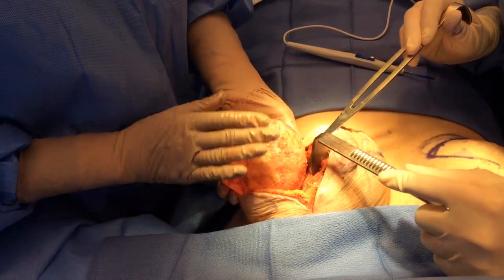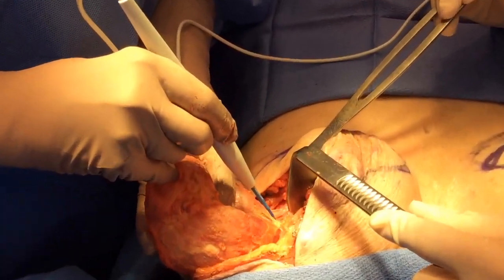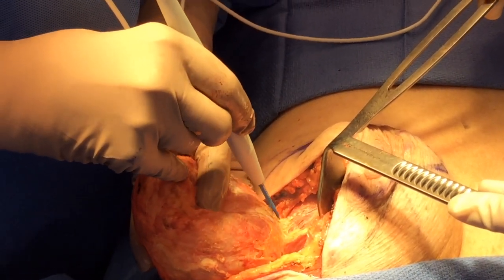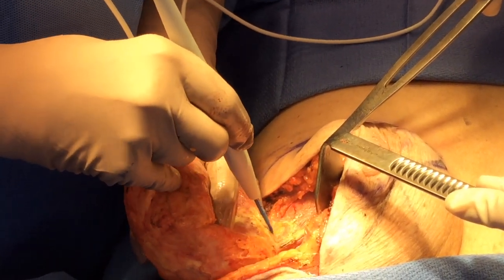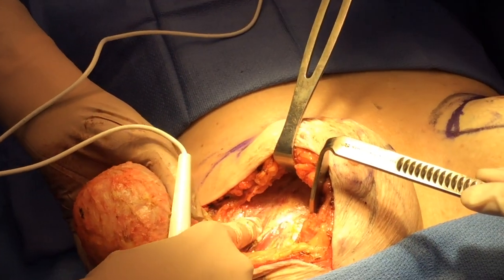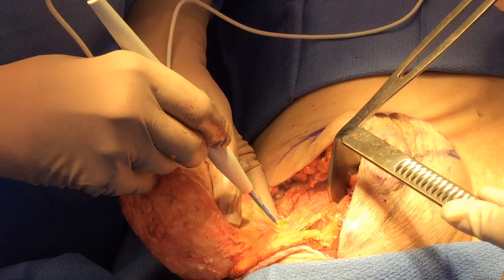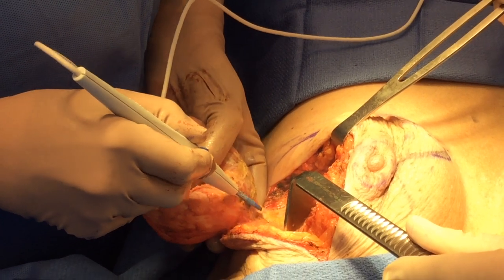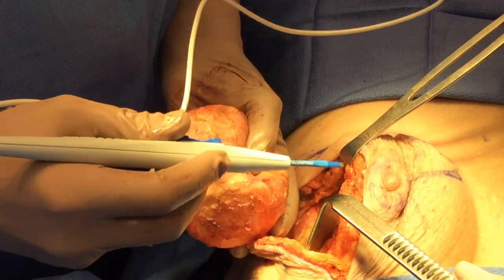So I have implant, scar tissue, no additional breast tissue. I'm going to just gently tease the rest of this capsule off of her pectoralis major muscle, not interfering with the good fascia that's on that muscle. As you can see, she's got a nice healthy muscle here with her fascia on it. This is just the end of my dissection — I thought it would be fun for you to see this in its entirety.